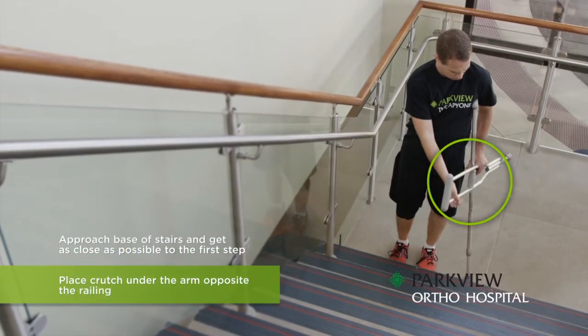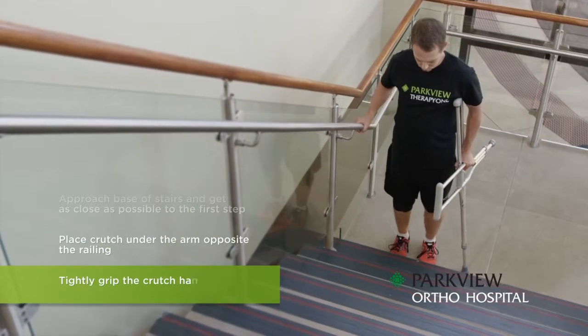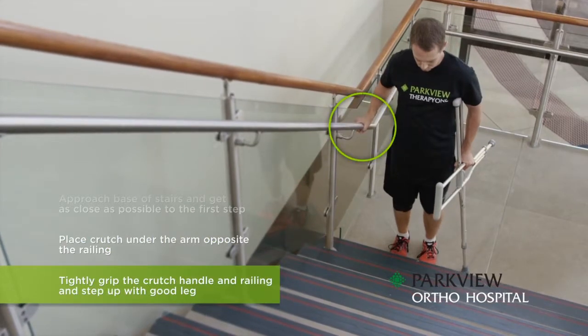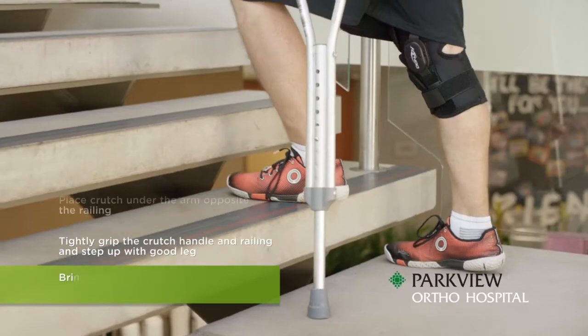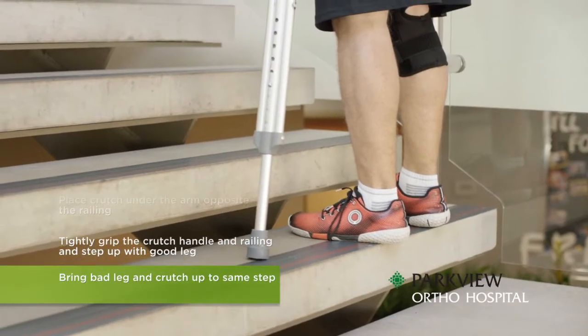Place a crutch under the arm opposite of the railing. Tightly grip the crutch handle and railing and step up with your good leg. Next, bring your bad leg and crutch up to the same step. Repeat this process until you have reached the top of the stairs.